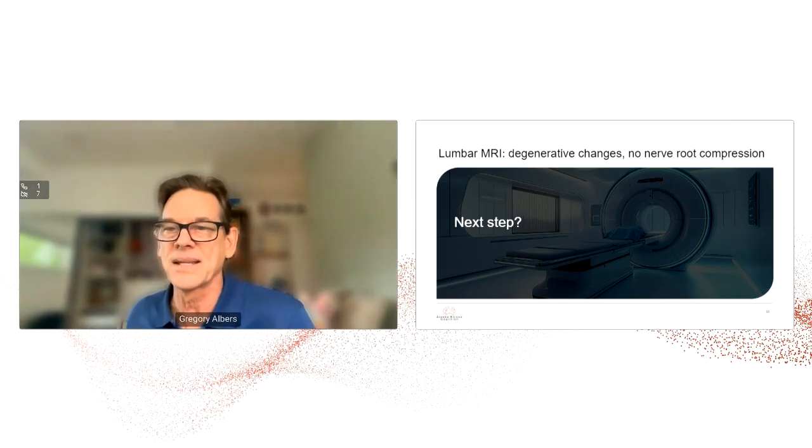So you can get unilateral leg weakness from a stroke in that area. And so certainly I'd want something, again, like we had before with the vertigo case, either an MR or a CT perfusion to try to rule out an anterior cerebral artery stroke. Excellent. So let's take a look at what happened here.